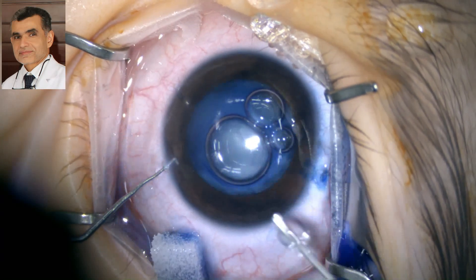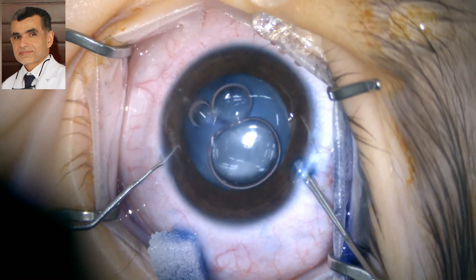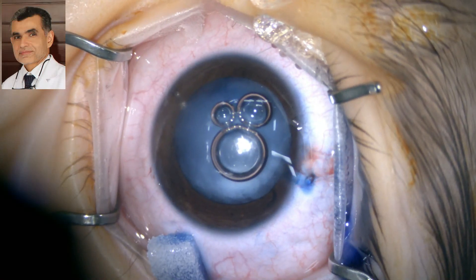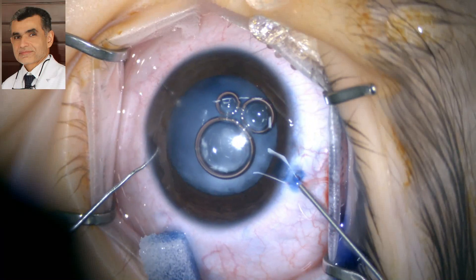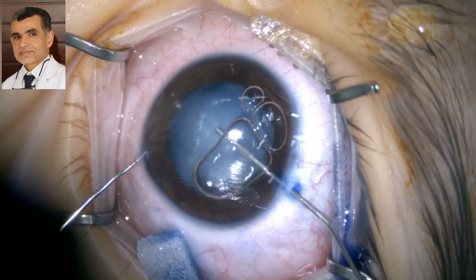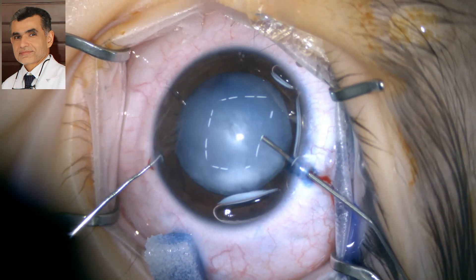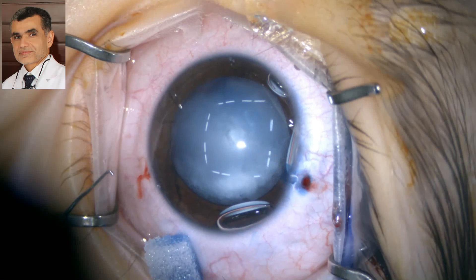We perform two paracenteses. Because it is a white cataract, we apply capsular stain. This is very vital because we need to achieve good capsular access, which is usually not easy at young age. We inject the capsular stain and then wash it out with BSS.